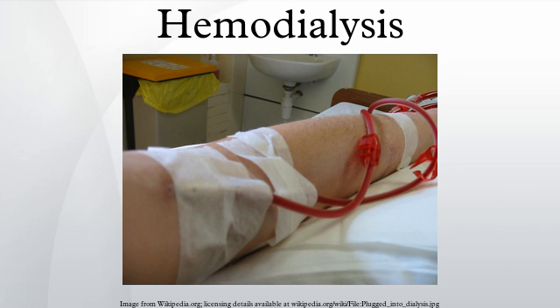Dialyzer reuse is a practice that has been around since the invention of the product. This practice includes the cleaning of a used dialyzer to be reused multiple times for the same patient. Dialysis clinics reuse dialyzers to become more economical and reduce the high costs of single use dialysis, which can be extremely expensive and wasteful. Single-use dialyzers are used just once and then thrown out, creating a large amount of biomedical waste with no cost savings. If done right, dialyzer reuse can be very safe for dialysis patients.